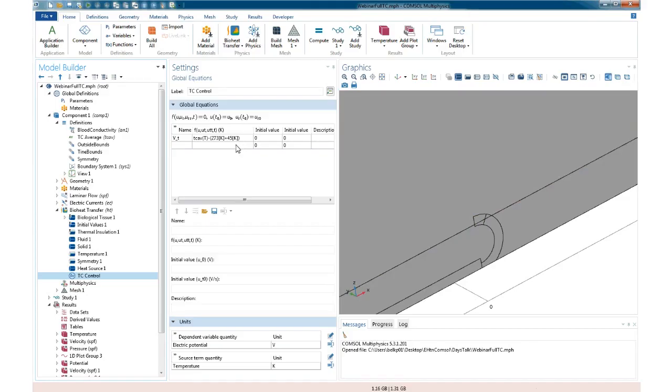And what it will do is it will change the voltage that I put here until this equation is 0. So it's a very basic feedback equation. I'm setting it up, but the components it has are something that it can measure, in other words, something that will change as the simulation evolves, and something that it controls, which in this case is the voltage.